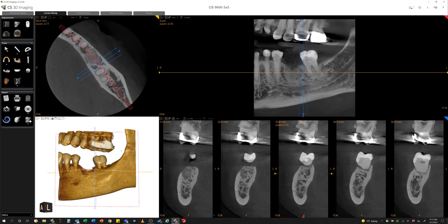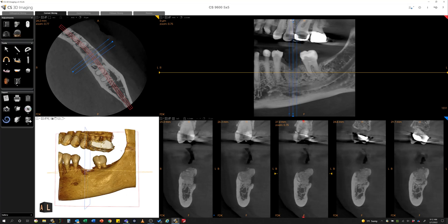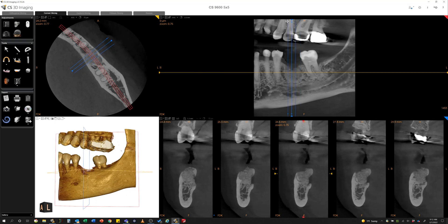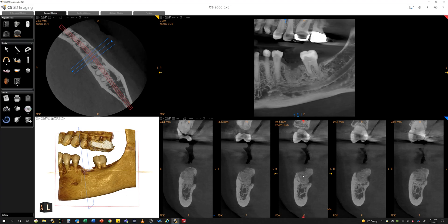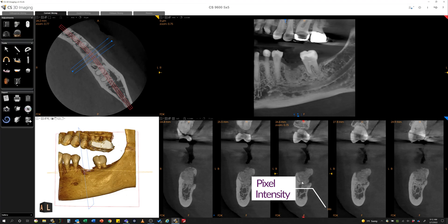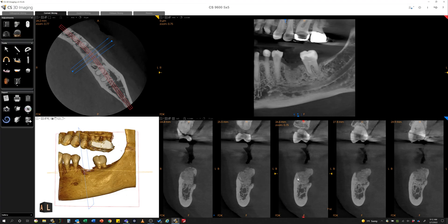I'm going to move over to the implant site. There is that implant site. As we can see down in the transaxial view — the center view — we have values around 327, 275, and the value is a little bit higher on the cortical plate. And then as we move that into the nerve canal, we can see that number dip down into the negatives. So this pixel value is intended to give an idea of density in the radiographs.